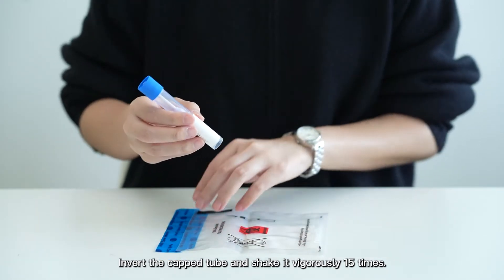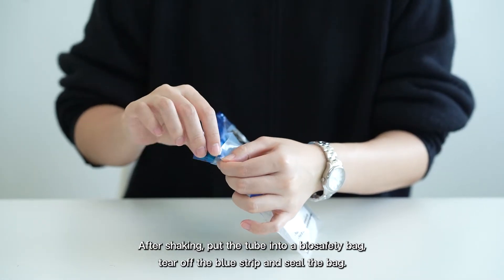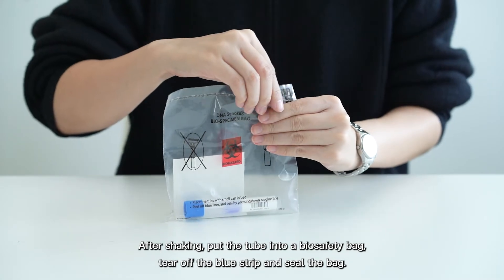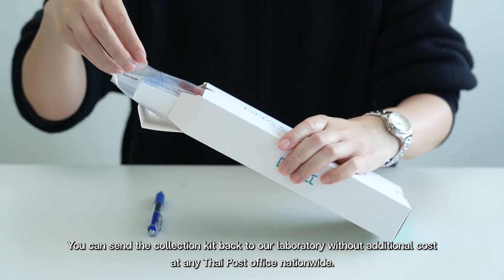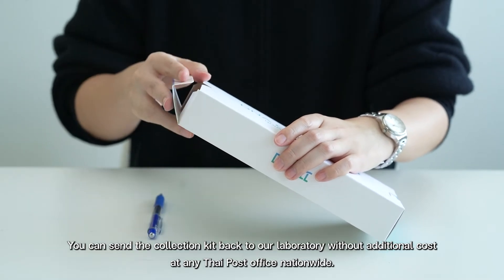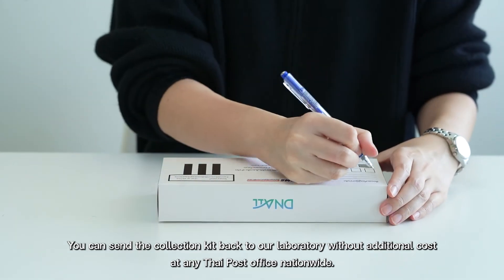Shake 15 times. After shaking, put the tube into a biosafety bag, tear off the seal strip, and seal the bag. Put the sealed tube into the box. You can send the collection kit back to our laboratories at no additional cost at any type of post office nationwide.